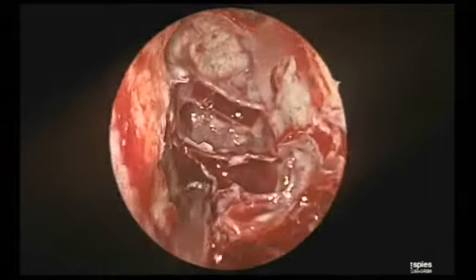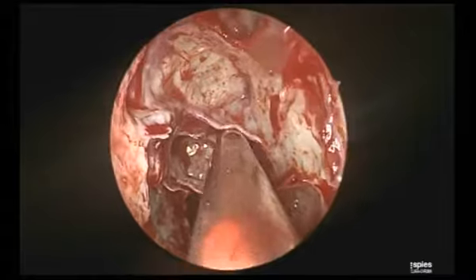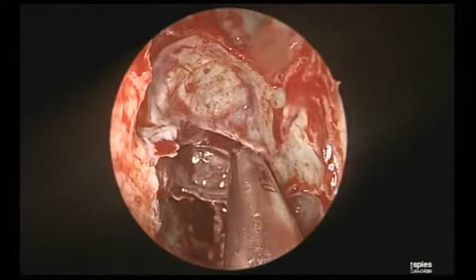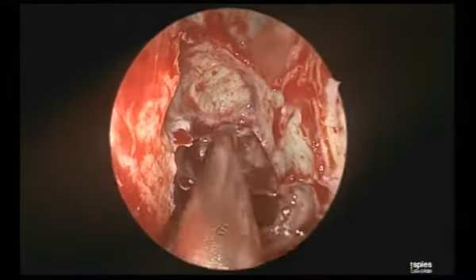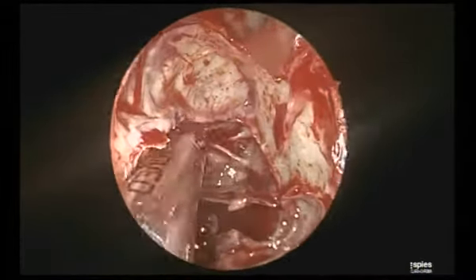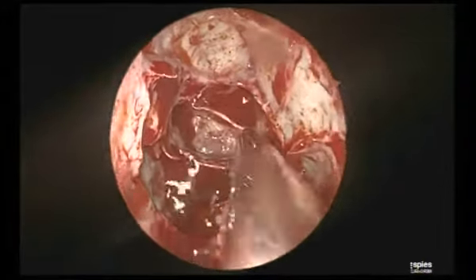You can rotate it, you can also use it like a probe. He cracks it. See that? He's cracked its posterior part. Now beautiful, that is your skull base. See, that is very clearly seen. The anterior ethmoidal artery, the skull base, the posterior ethmoidal somewhere there.